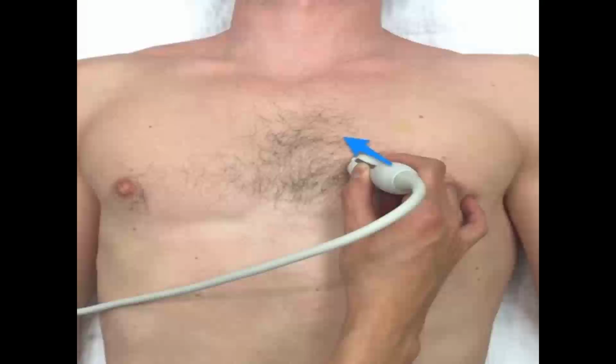As we can see, we start by the parasternal views. It's from the third space, second space. There is nothing absolute about it. You have to do it when you see the best view in the patient. And if you don't see properly, let him lie on his left lateral position so that you can gain a proper view.